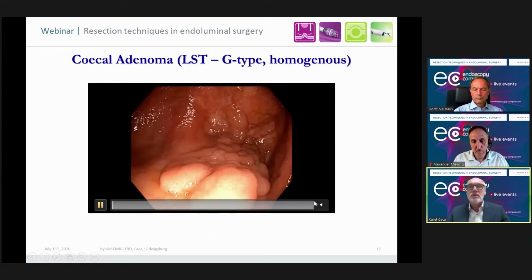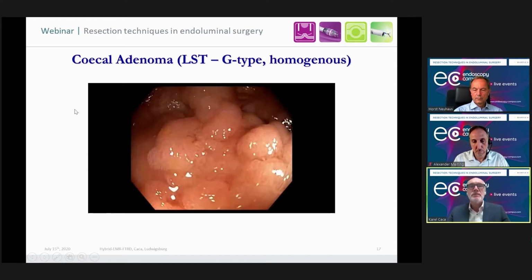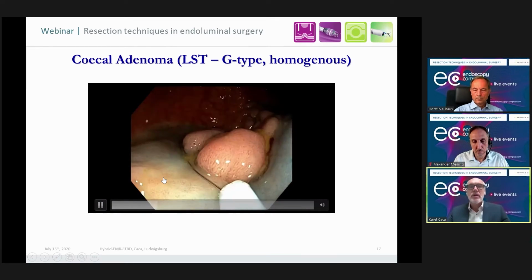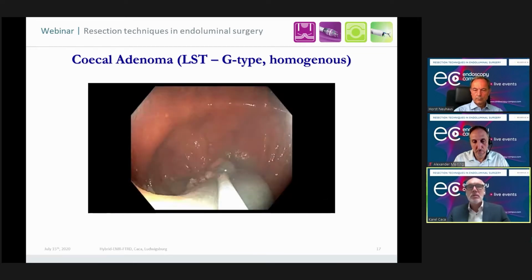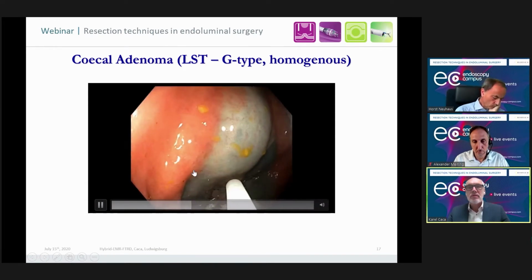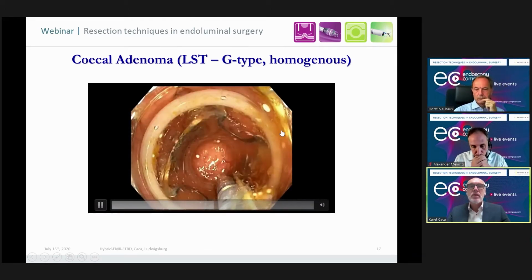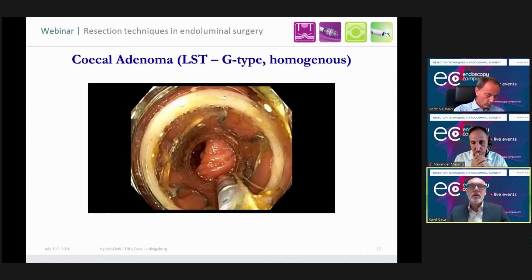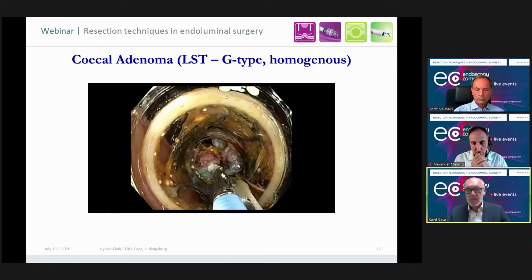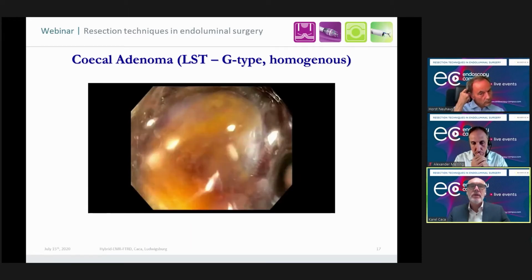Let me give you an example. This was a lesion in the cecum, not involving the appendiceal orifice. You can see I started out by lifting the lesion and did a nice EMR, and I thought I would be able to EMR resect the whole lesion. Everything looked nice. But then I saw this area that was non-lifting, so I was still able to resect most of the margins of the lesion, and then I went in with the FTRD resection device, which everybody is familiar with, grasped it, pulled it into the cap, and then snare resected, as we all are familiar with now.